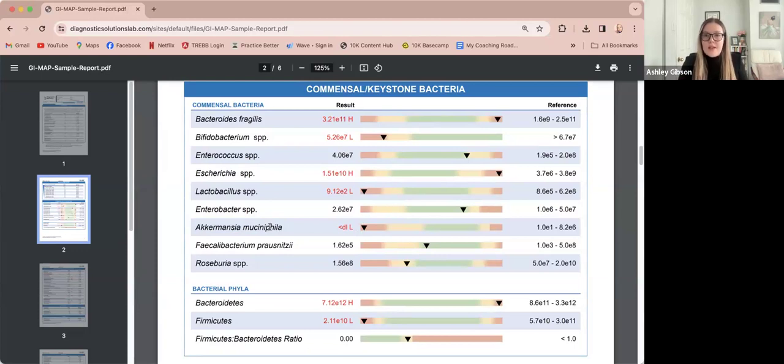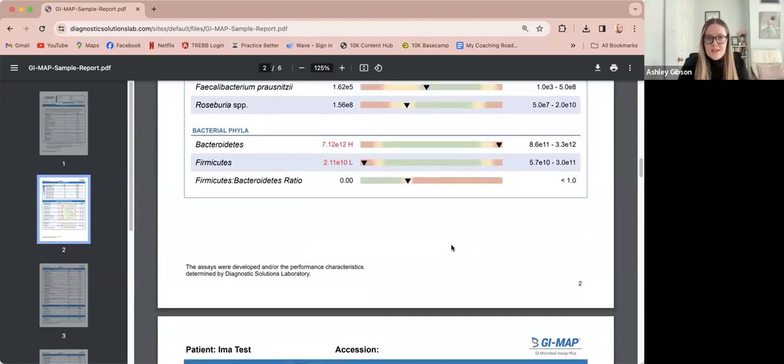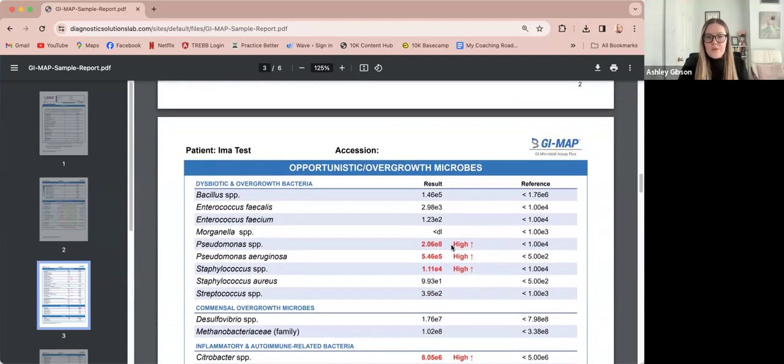With leaky gut, we're going to see an immune system activation. We're going to see things like headaches, food sensitivities, even joint pain, mood changes, etc., lack of nutrient absorption. So when we see imbalances here or dysbiosis here, we really got to support and rebuild the beneficial bacteria in the gut. That's sort of step two. First we got to get rid of the harmful, then we got to rebuild. Okay, so again, to keep this video a little bit more concise, I'm going to keep moving through.